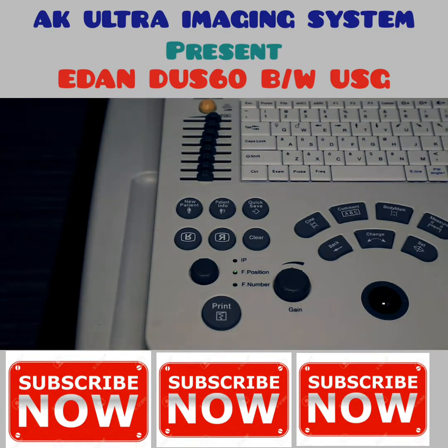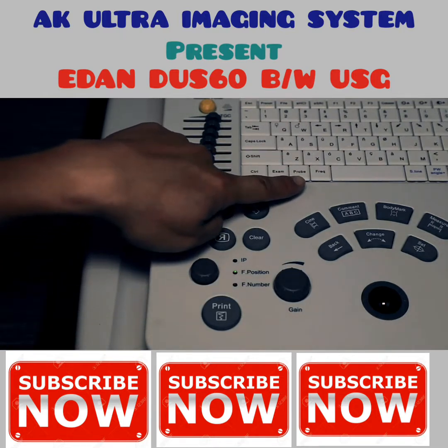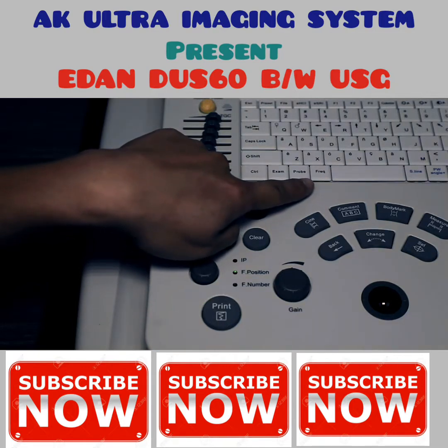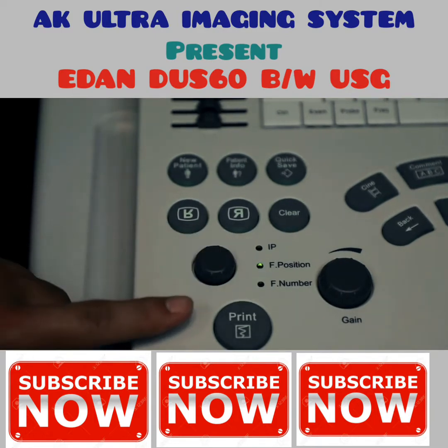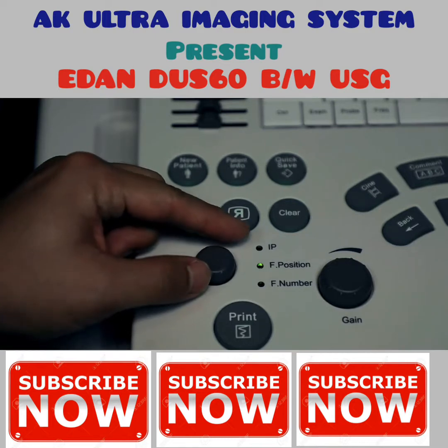Frequency: high frequency gives high resolution but low penetration; low frequency gives low resolution but high penetration. To change frequency, press the frequency key. Next, adjust the focal point — press the knob down to highlight the focal position, turn the knob to place the focal point at the desired area.